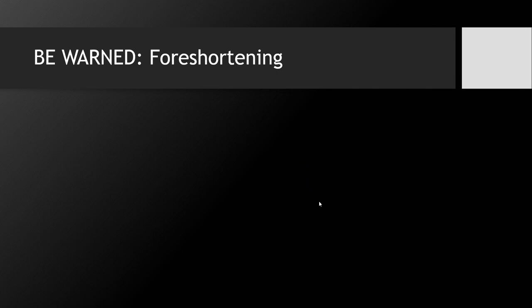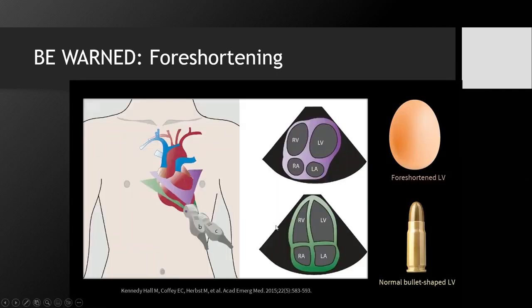Now, a couple of caveats, things to look out for, common pitfalls when you're taking an apical 4-chamber view. The first is that, I mentioned, you usually want to have this bullet-shaped LV, RV, bullet-shaped ventricles to atria. And you can see that this green echo correlates with this green echo probe, which is perfectly slicing the heart in its midline.